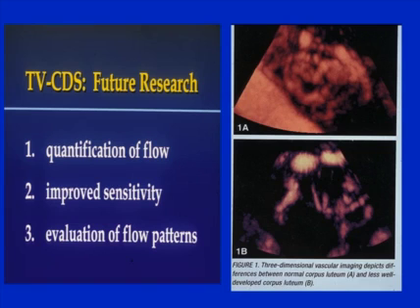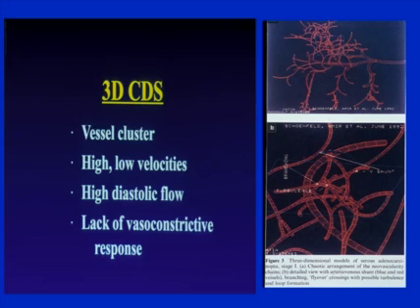Now, the advantage of 3D allows us to see the vessel density and their relative branching pattern, as well as their vascular caliber. And so 3D is in fact helpful in looking at some of these tumor vessels, and I've shown you already that with tumors there's a cluster of vessels. The vessels have very abnormal branching patterns.